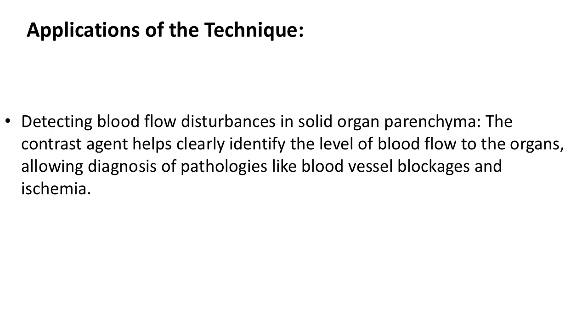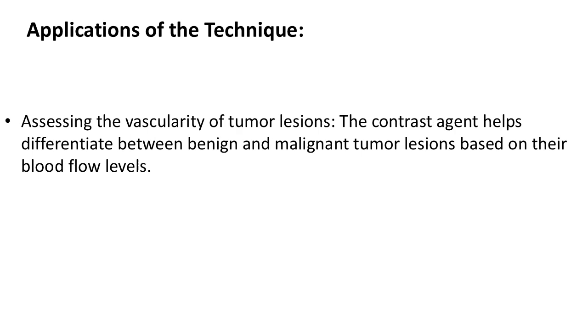Applications of the technique: detecting blood flow disturbances in solid organ parenchyma. The contrast agent helps clearly identify the level of blood flow to the organs, allowing diagnosis of pathologies like blood vessel blockages and ischemia. Applications of the technique: assessing the vascularity of tumor lesions.